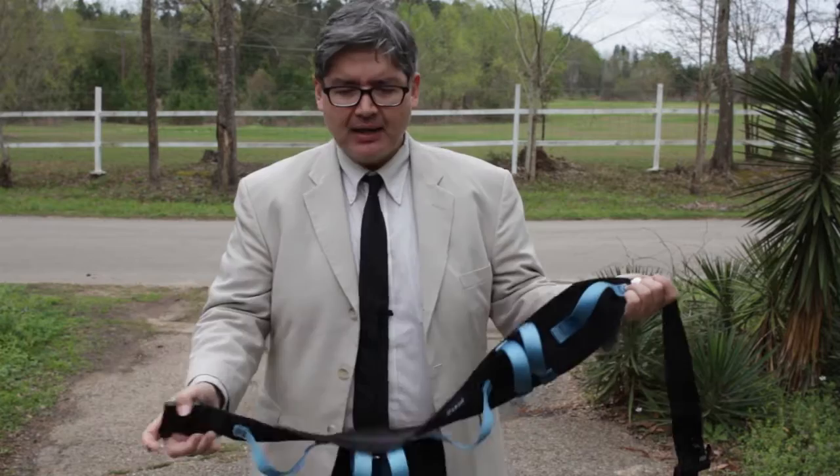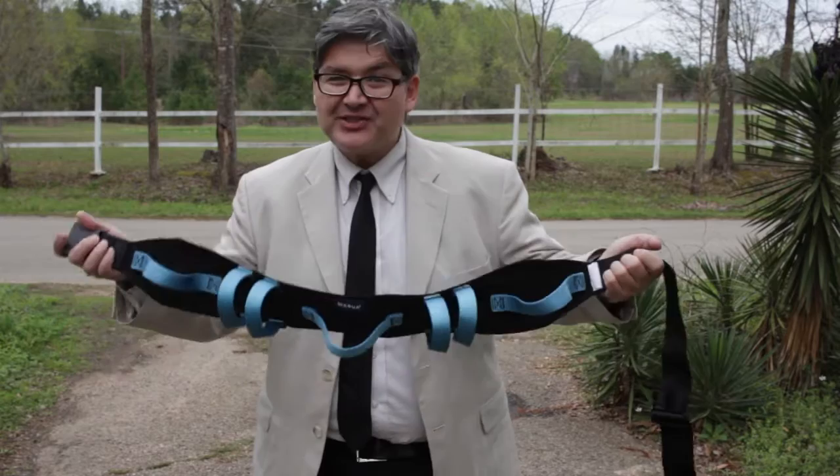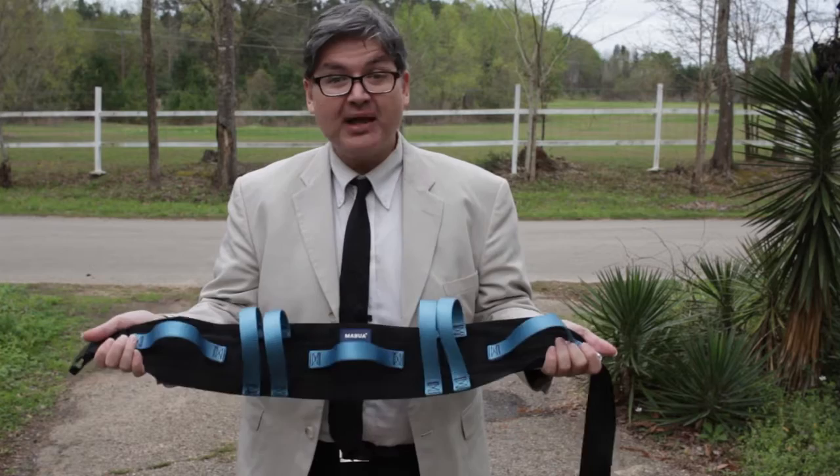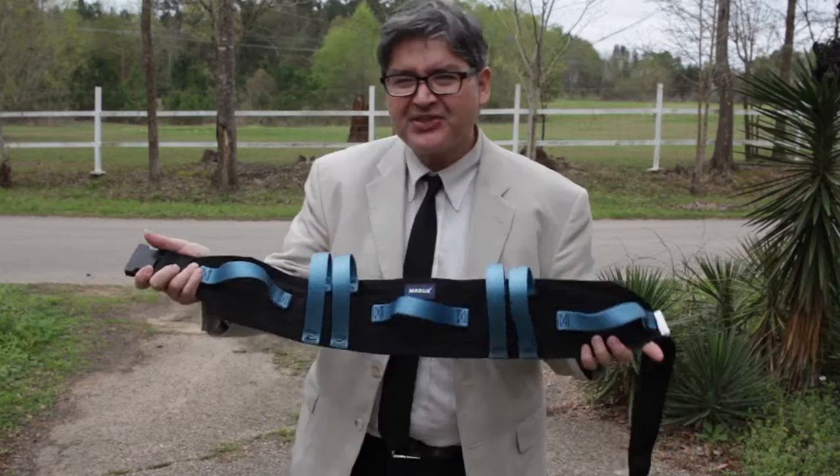A lot of folks in the medical profession — doctors, nurses, and folks that do rehab — know about these gait belts, GAT belts. Most folks that aren't in that field don't know about this, but if your folks are getting older, if you're getting older, if you have someone with mobility issues because they hurt their leg or had an accident, this is something that would really make a big difference in everybody's lives.